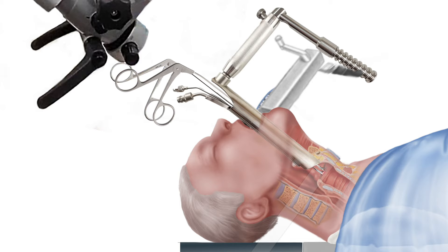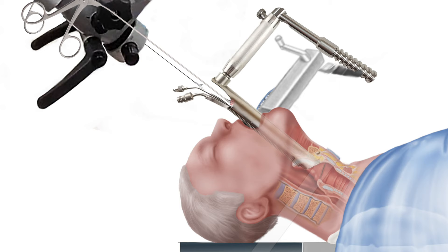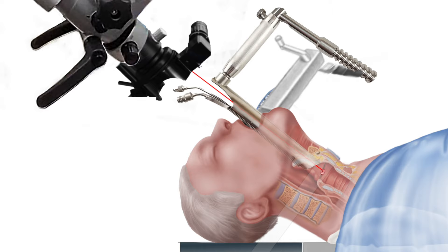Tiny scissors are then used to cut the mass from the underlying vocal cord tissues. The mass is then removed from the throat and sent to pathology, where it will be processed, evaluated under the microscope, and provide a definitive diagnosis. Depending on the situation, a laser may be used to excise or ablate the vocal cord mass.